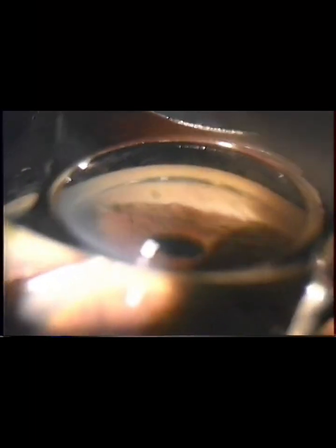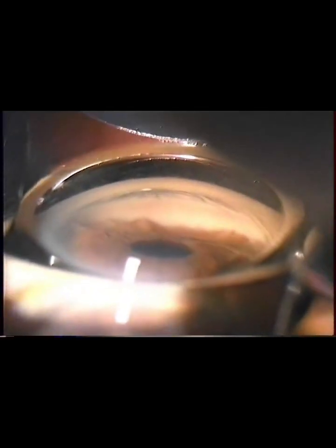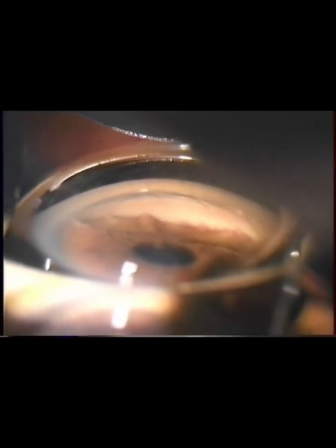As this eye with a closed angle is indented, one can see periodic areas of adhesion. This patient had a history of having a laser trabeculoplasty, and these may be areas where the iris was welded to the iridocorneal angle and the cornea.